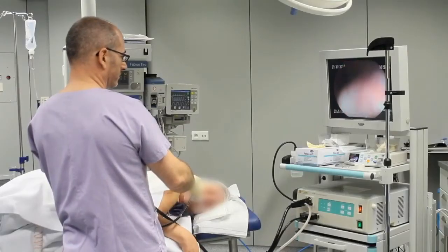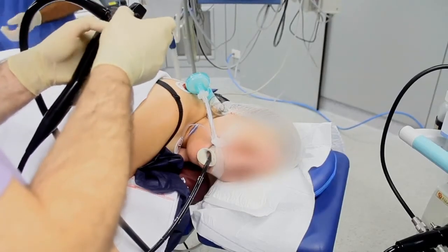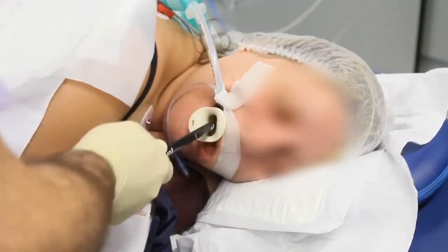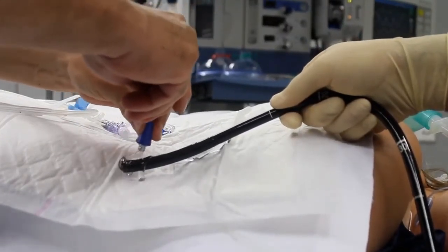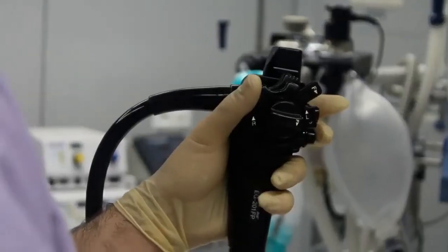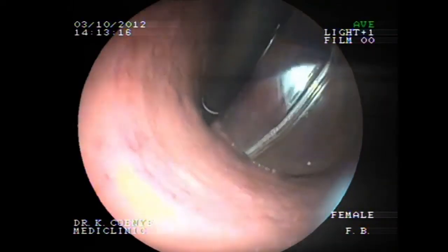Balloon extraction procedure. The balloon must be removed after a maximum period of 6 months. General anesthesia is also recommended for this procedure. The patient must be fasting and intubated in a left lateral decubitus position. Lubricate the endoscope with anesthetic gel, xylocaine or KY. Then, using the endoscope, check the condition and integrity of the balloon, as well as for the absence of digestive lesions.